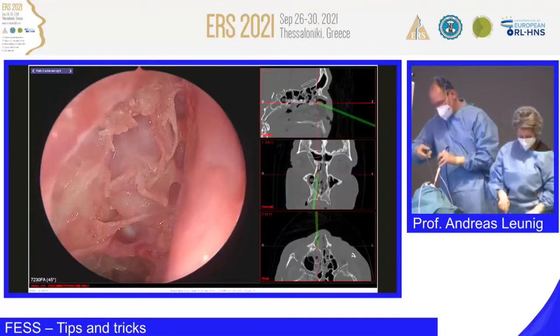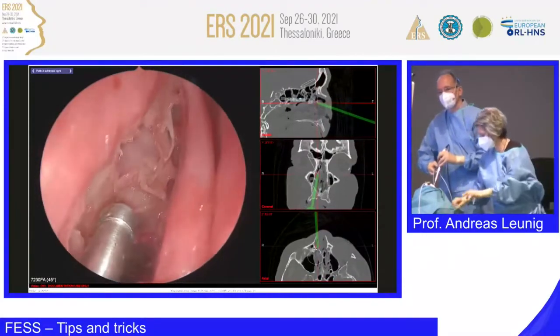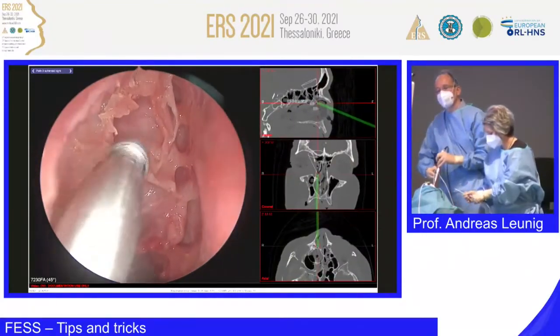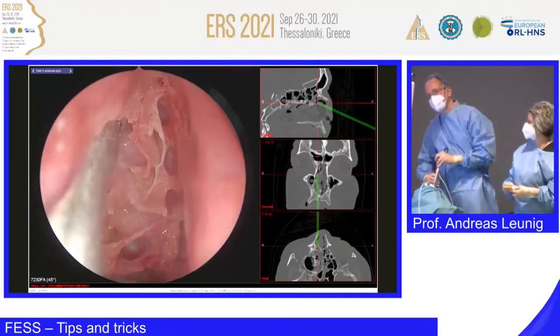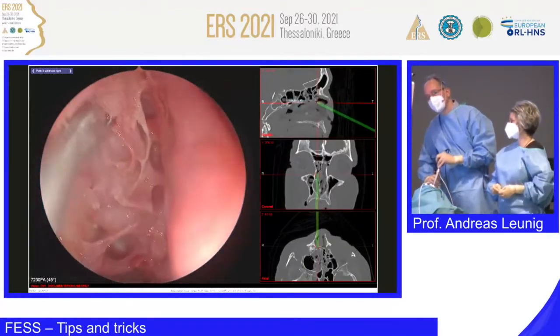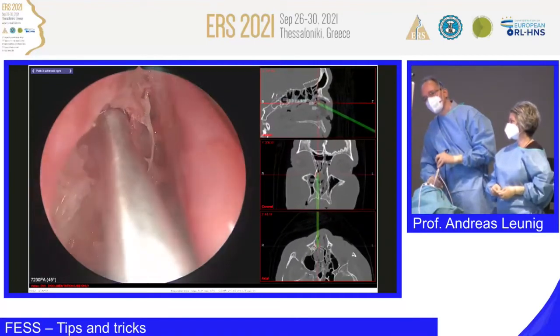I think there's still a cell here, which could be opened. We will see if this is skull base or not. But now I'm taking the mushroom punch and I'm going up here. I'm just exposing the drainage pathway.